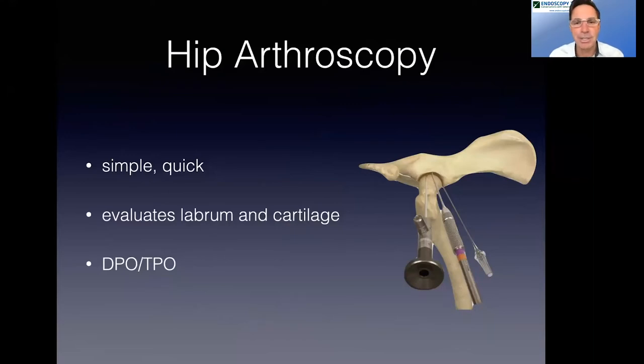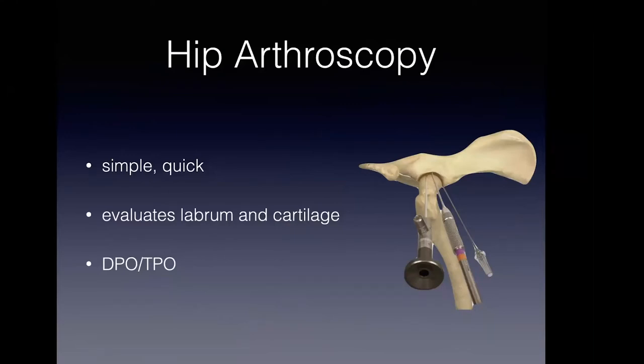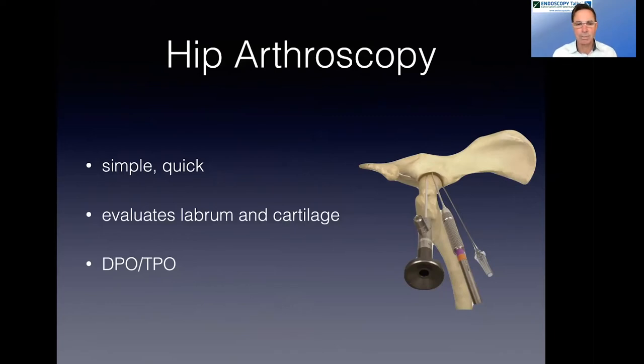All right, well, let's move on to the back of the dog, and we're gonna look at the hind limb. And a lot of people don't think about hip arthroscopy, and there's not a lot of indications for it, but hip arthroscopy actually is very easy to do. It's very simple, very quick, very easy to get into the joint. I primarily use hip arthroscopy now as a tool to assess dogs whether they're going to be an acceptable patient for DPO or double pelvic osteotomy. So I'm doing this in juvenile dogs. I also will do it in some dogs that have had hip dislocation to assess the cartilage before I actually go into the joint. And again, I have used it to assist me in placing a prosthetic round ligament as well, or a toggle ligament.